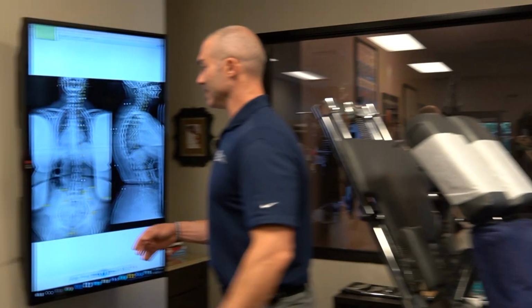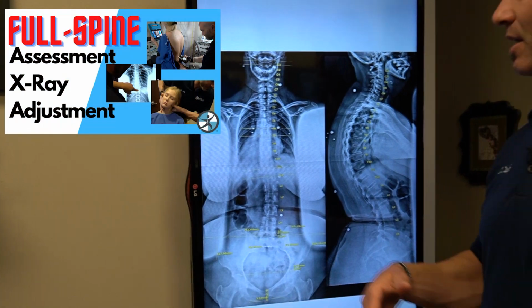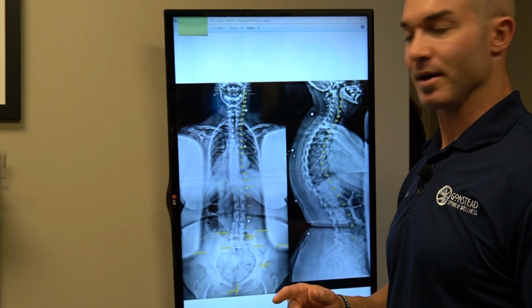So now, how do we do this? Well, we address segment, posture, and movement. All 3 of those things have to be addressed. What does that mean? Segmentally, let's go over here. Segmentally, we have her x-ray. Watch some of our other videos. You can see how we do a full spine workup with our patients. I'll put a link up above to one of the workups we did on another patient.